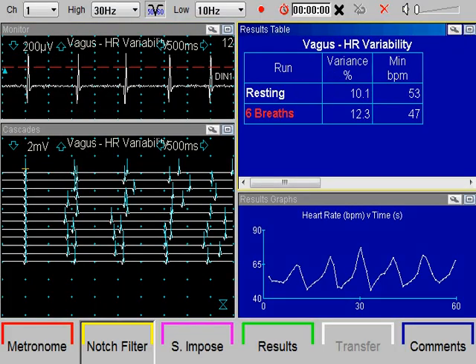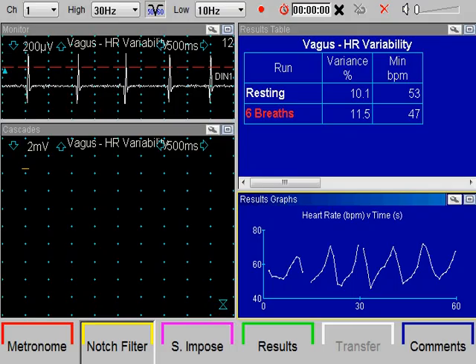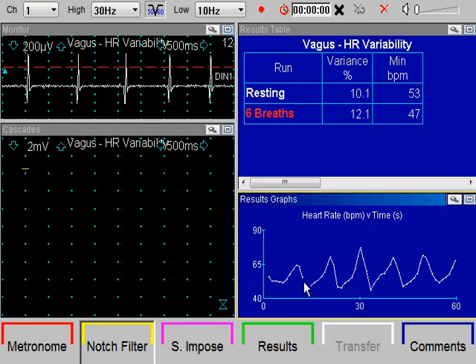Sometimes we may get so-called ectopic beats, or we may get very high or very low rate because of noise and interference that triggers the sweep. Such data points can be excluded from analysis. As an example, let's say that I want to reject this very low value of heart rate. Right click and that will remove this data point. Or I can remove this data point. To re-include those points, place the mouse in that vicinity, right click and re-accept the data.